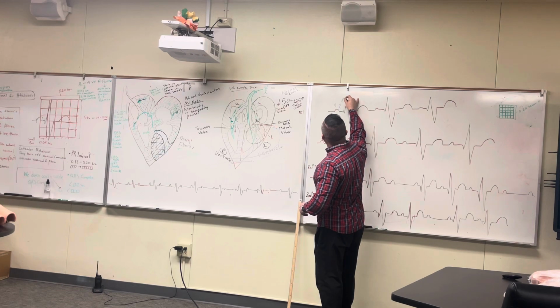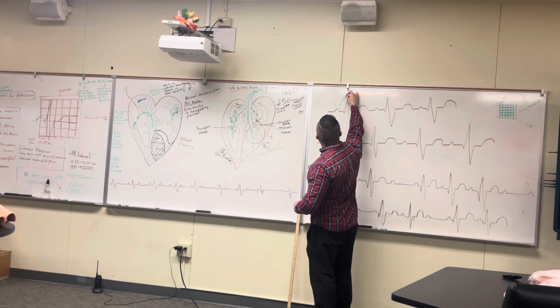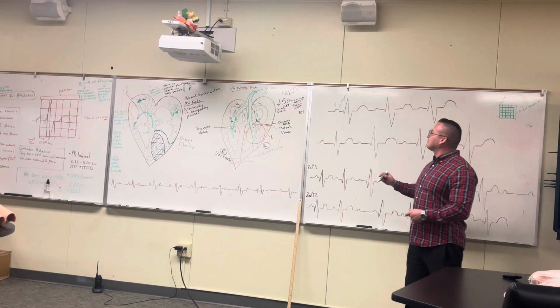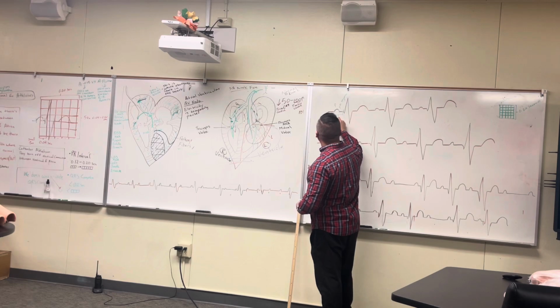Okay, what about from before the P to the QRS? What's that called? PR interval. So from here to here, this is the PR interval.